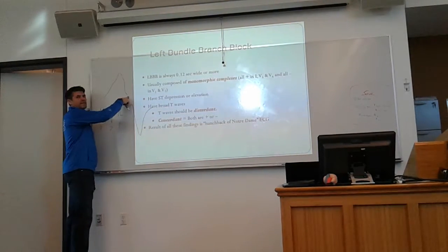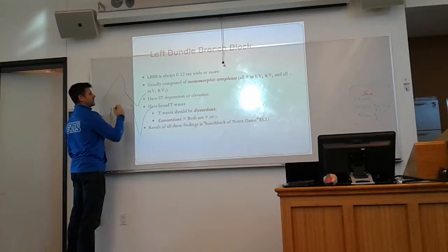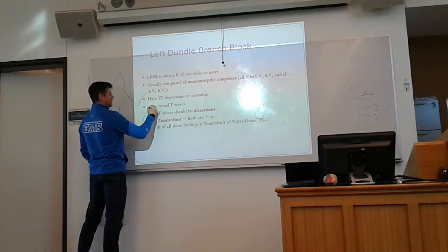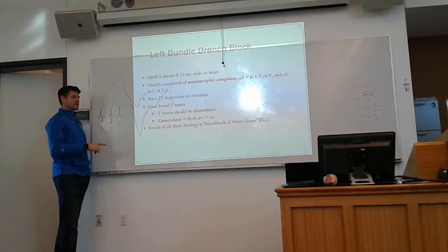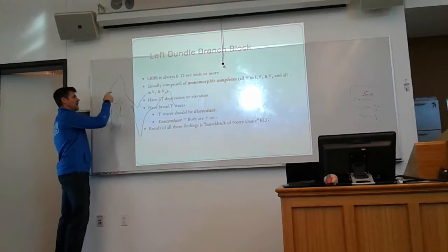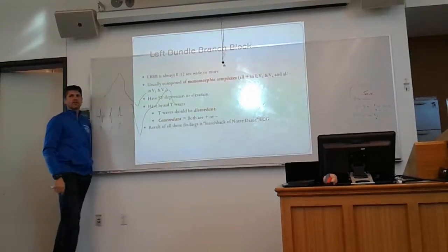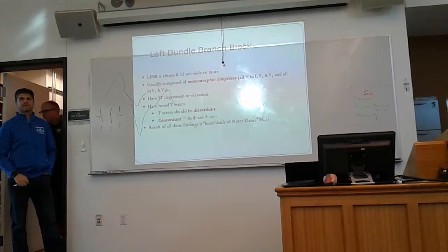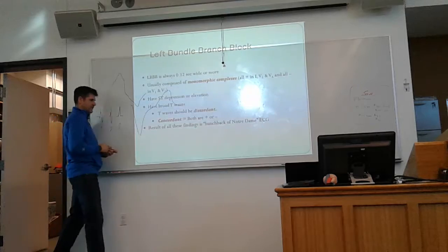Discordance means it's going to go in the opposite direction. So that's my T wave there, and here, that's my T wave there. Two separate things. QRS complex is monomorphic, which means it's all positive or all negative. T wave is discordant to that QRS complex. So really, that's the easy way to see. Yes, that's correct. That's right.